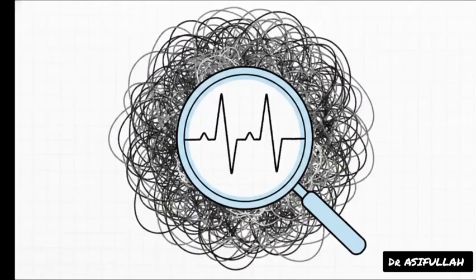Now, what if you're dealing with the left bundle branch block? Well, that naturally skews the ECG, right? It makes typical ischemia incredibly hard to spot. That's exactly when you deploy the modified Sgarbossa criteria. You're looking for concordant ST elevation greater than 1 millimeter in any lead, concordant ST depression greater than 1 millimeter in V1 to V3, or proportionally excessive discordant ST elevation. These criteria allow you to rapidly diagnose if an underlying ischemic event is happening right in front of you, cleverly cutting through all that visual noise caused by the block.